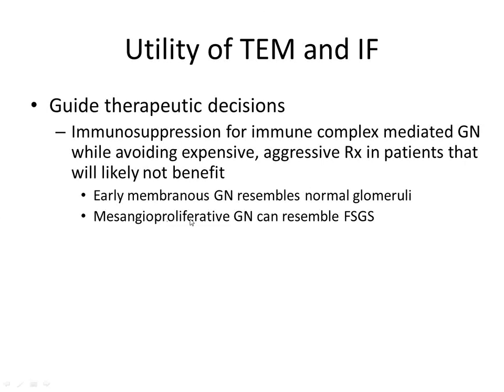Similarly, if you have immune complexes in your mesangium, sometimes it'll cause expansion of the mesangium and even sclerosis of the tuft. And I apologize for some of the residents that haven't seen this FSGS acronym, but it stands for focal segmental glomerulosclerosis. I need to make sure I define my acronym, so I apologize for that. What it means is that a part of the glomerular tuft is sclerotic.